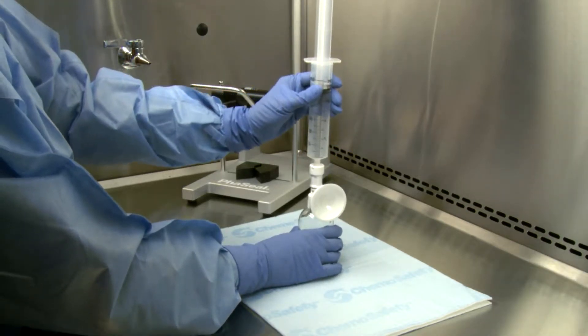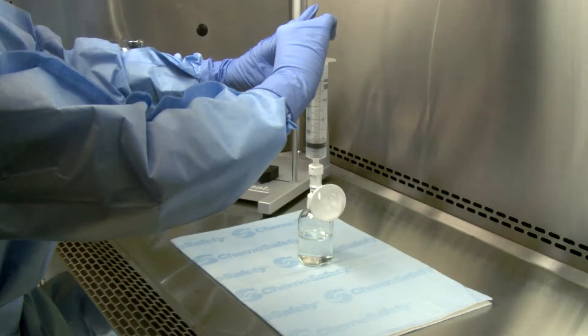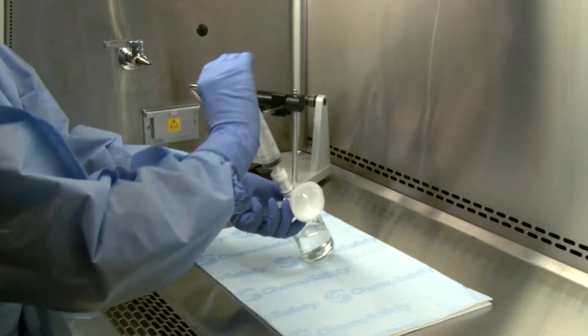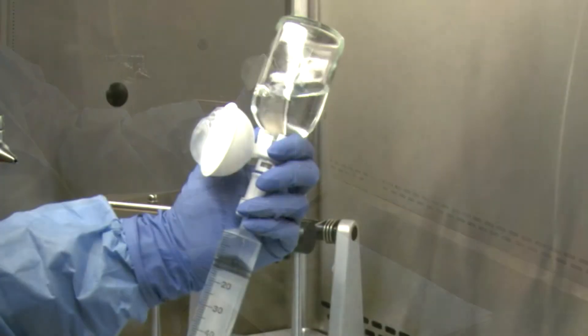Keeping the vial upright, push the diluent or air into the vial. The expansion chamber will inflate. If reconstituting, follow the drug manufacturer's package insert.